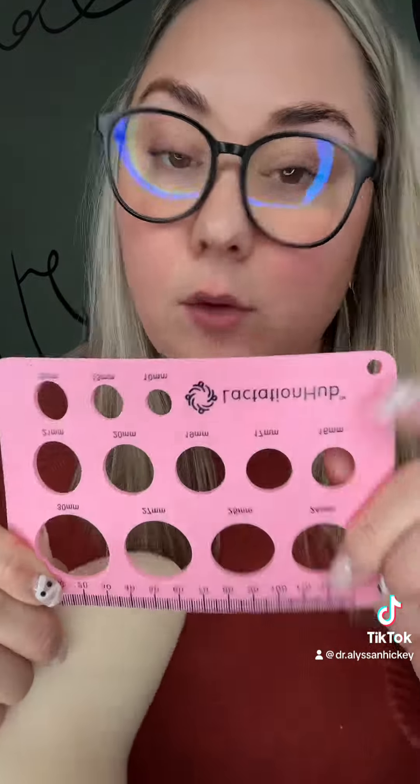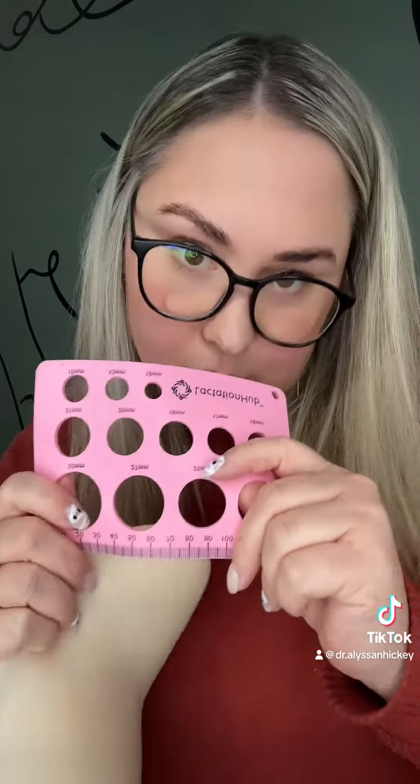Recently a lot of moms have been coming in and they're noticing that their output with their pump isn't that great, so we like to go through and measure them for flanges. Most pumps standard come with a 24 millimeter flange size. You can actually buy little inserts to put in the flanges to be the correct size for you. You can print one of these out online or you can go to Lactation Hub and buy a whole little kit that has pumping spray, flange sizes, and the measuring tool as well.